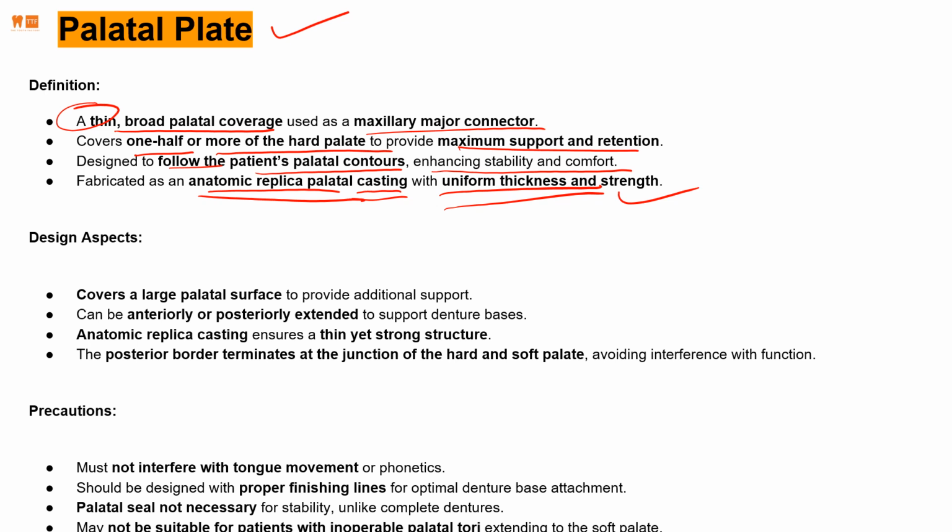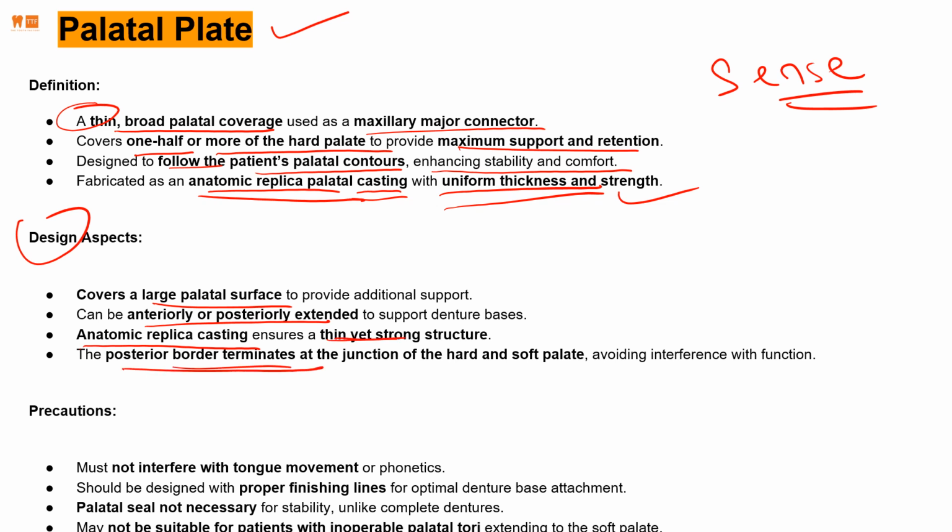But what it takes over is sensation. Remember that, guys. Okay. Design covers a large palatal surface, anteriorly or posteriorly extended, doesn't matter. Anatomic replica, thin in nature. Posterior border terminates at the vibrating lines and avoids interference with function.